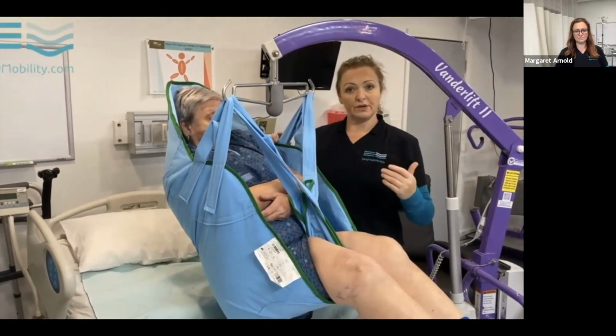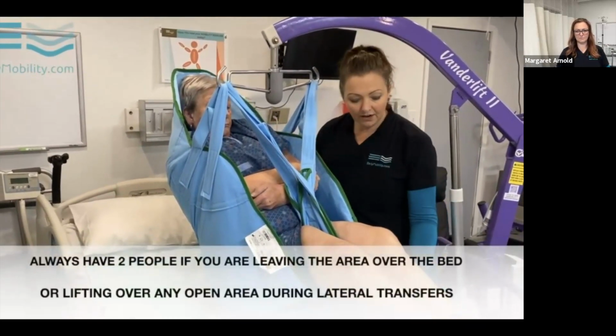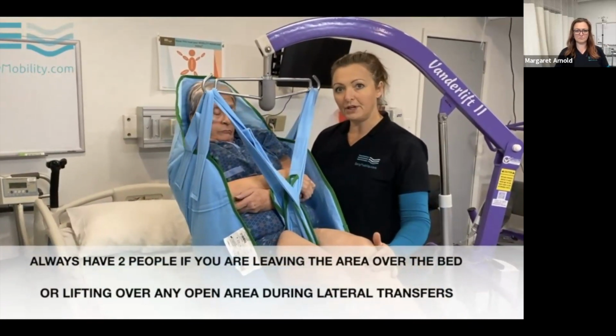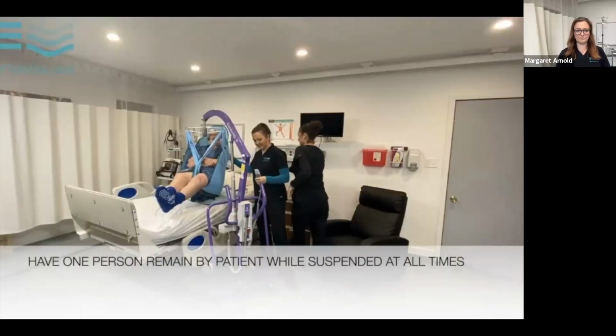If you are going to leave the area from the bed, you always want a second person. If you come up and just guide the patient here.